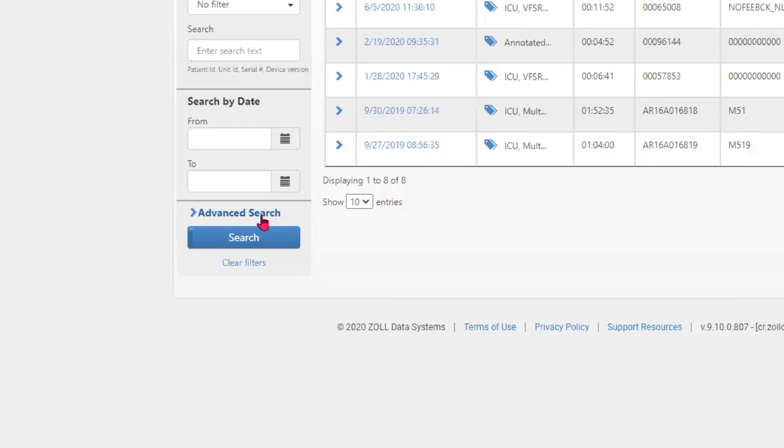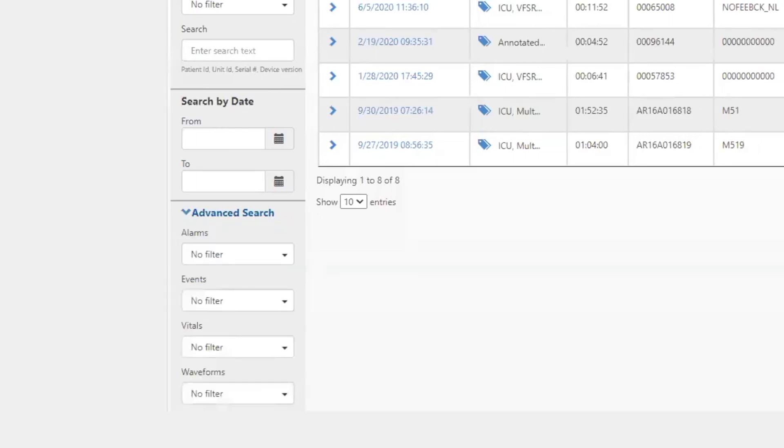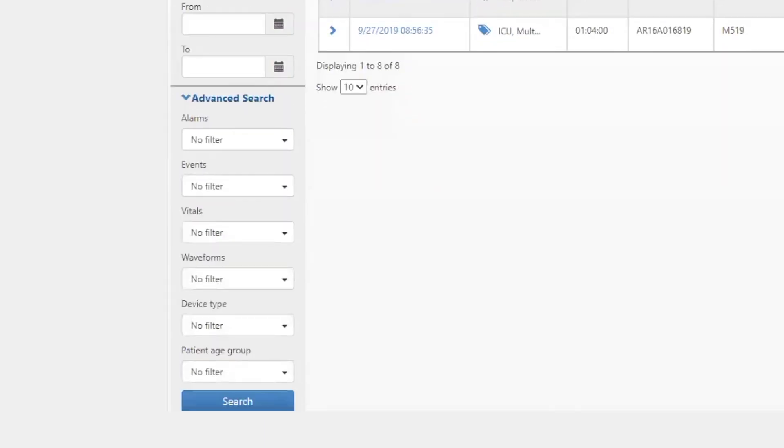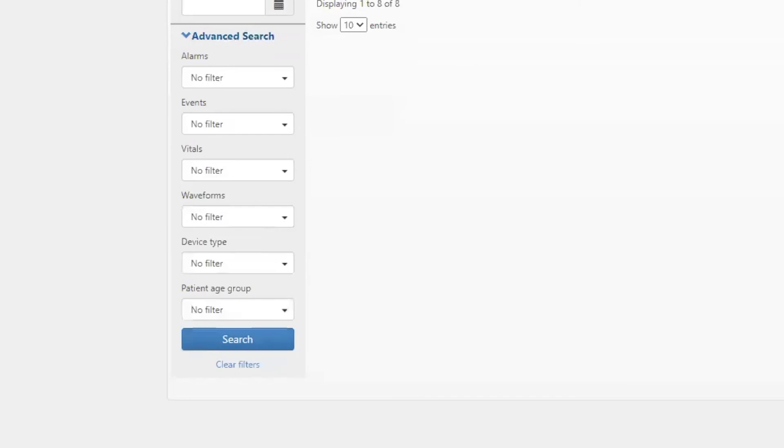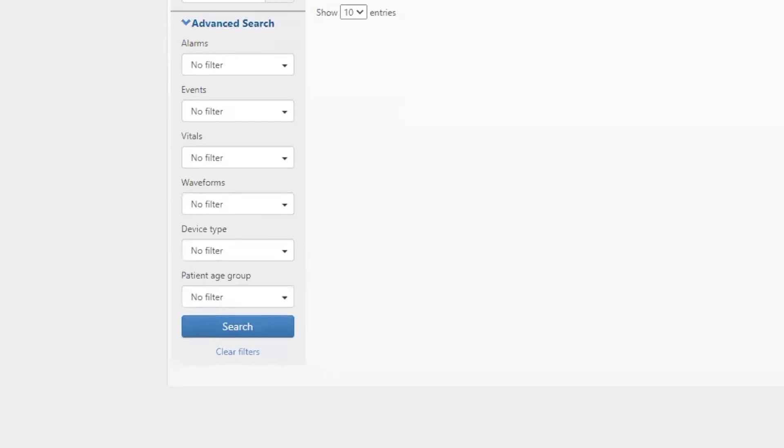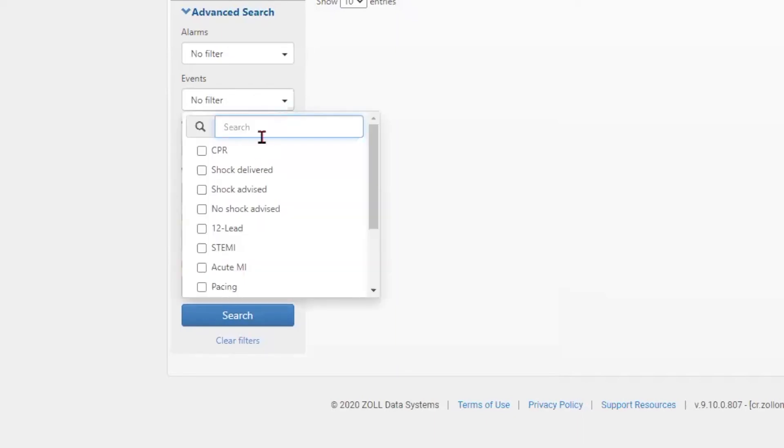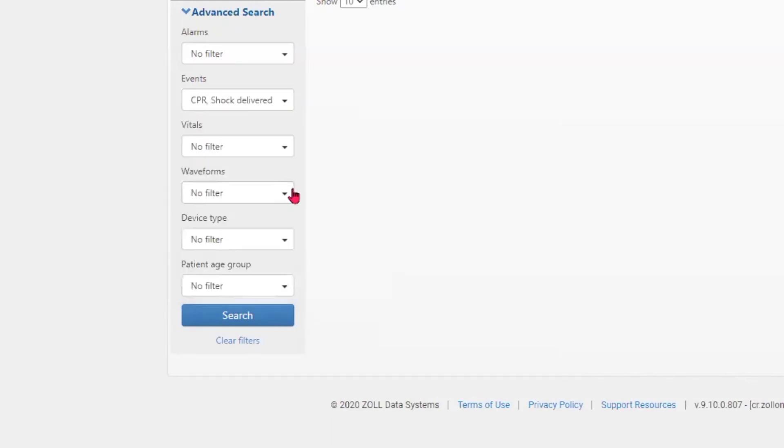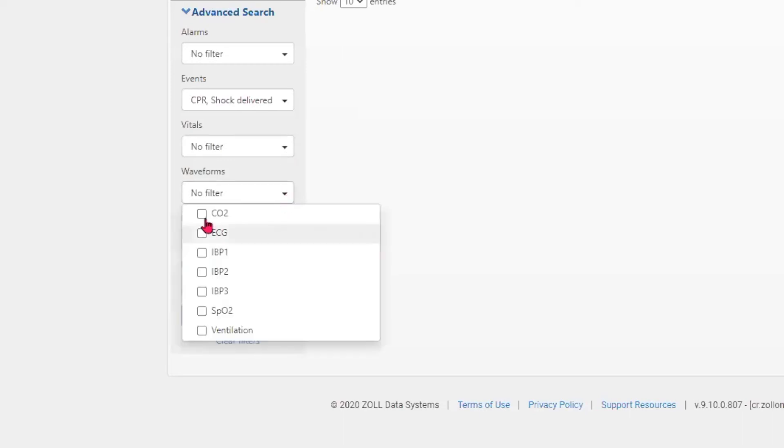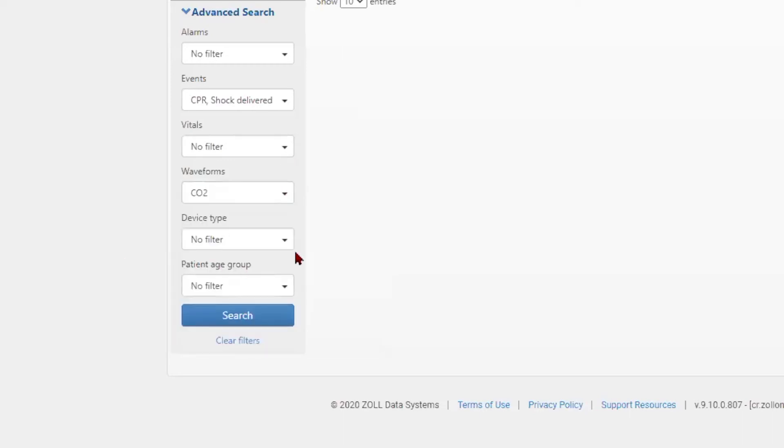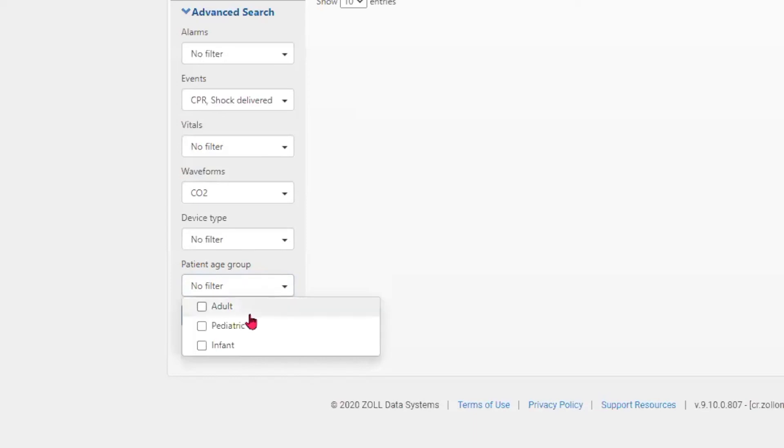The advanced search allows filtering by criteria such as alarms, events including those with CPR present or where a shock was delivered, particular vital signs, waveforms such as end-tidal CO2, device type, or patient age group. Cases that have been identified as either adult, pediatric, or infant can be filtered using the drop down menu in the patient age group.